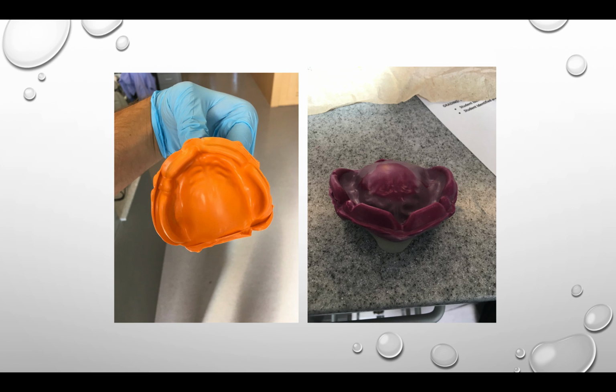You do the final wash when there are no large discrepancies in the custom tray that require heavy body. Use light body for the final wash and cover the custom tray completely with light body. Insert the custom tray into the patient's mouth and apply a lot of pressure. You want to do this so there are no air bubbles and you get a nice even seal like you see here on the screen.